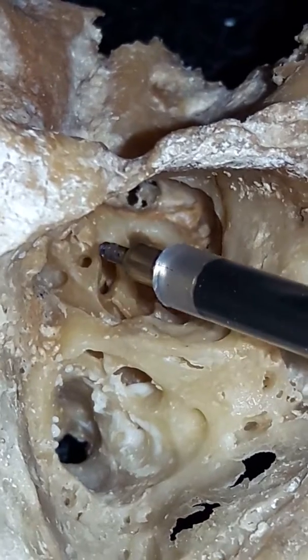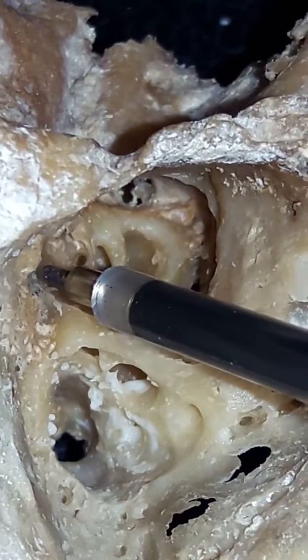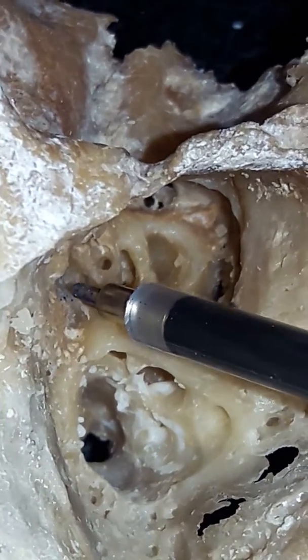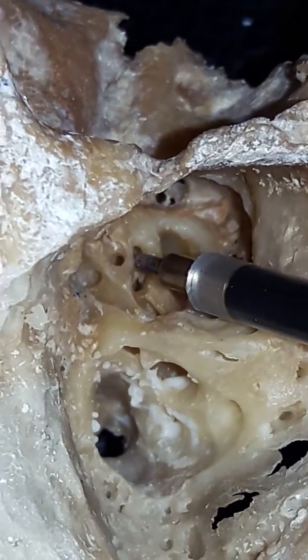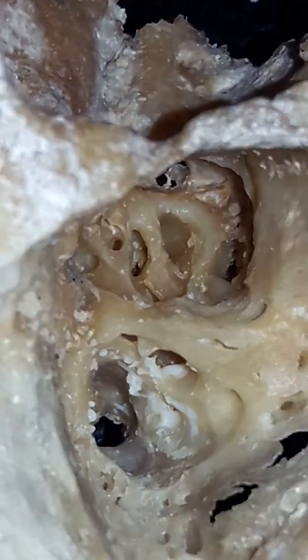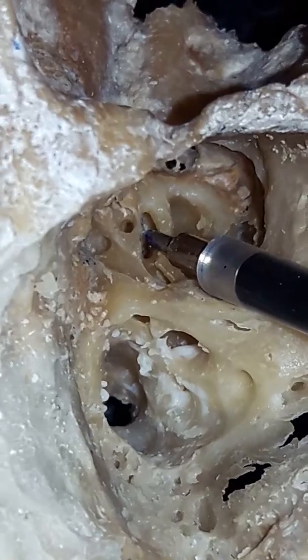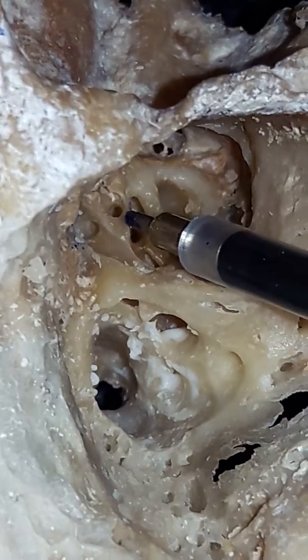Middle turn cochleostomy, middle turn drill out. So it is present here. Now here the labyrinthine part goes backwards like this. So I made a hole from here. Tomorrow I will show in the video, if I pass a ball probe here, it comes into the middle turn cochleostomy. So post-operatively, after cochlear implantation, if the patient presents with facial twitching, you have to see whether this part of the electrode is stimulating the labyrinthine part of the facial nerve. So we have to switch off that electrode.